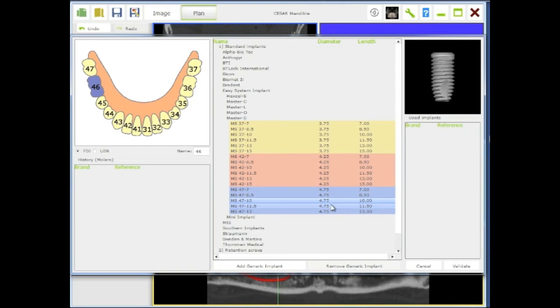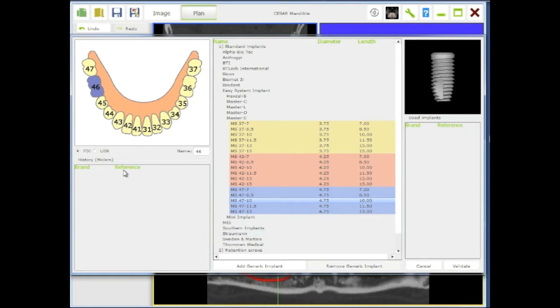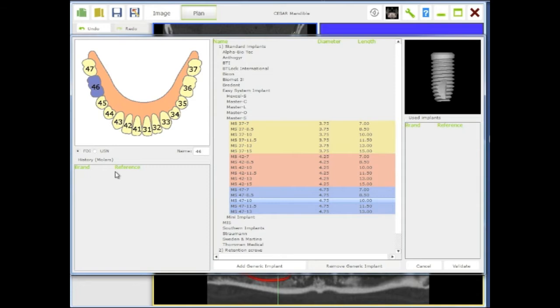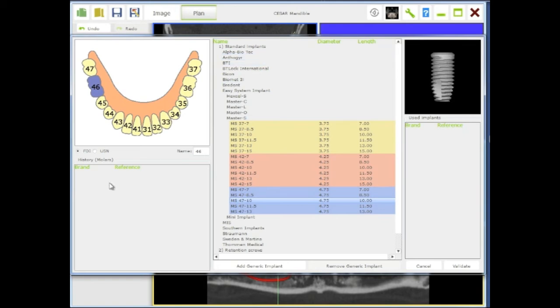When I click, I see the implant on the upper right side which is moving around. I can double click or I can validate. If you've been doing several cases for this tooth, you will see up to 10 options without needing to go inside this list.